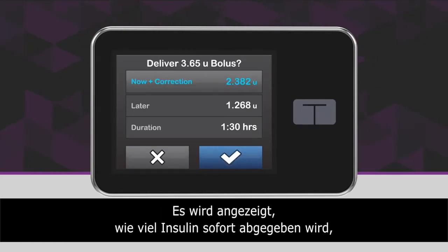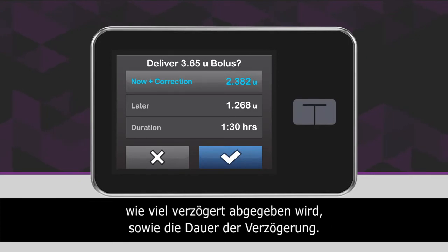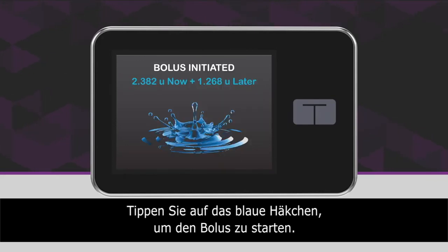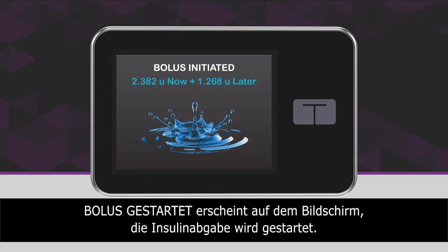The delivery screen will confirm how much insulin will be delivered up front, how much will be delivered over time, and the delivery duration. Tap the blue checkmark icon to start the bolus. The bolus initiated screen will appear to confirm delivery has started.